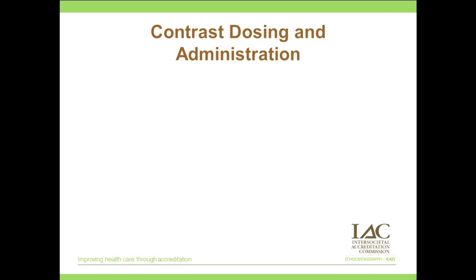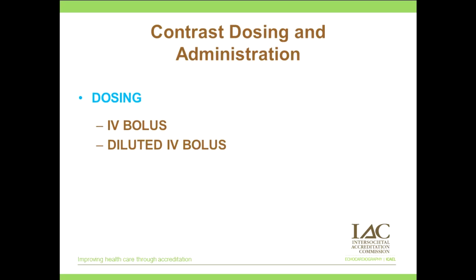So, contrast dosing and administration. Let's move on to this discussion. It's going to be a short discussion. Dosing can be either by an IV bolus, a diluted IV bolus, or continuous infusion. Personally, I've had experience with the IV bolus and the diluted IV bolus, but I've never used or seen the continuous infusion method.